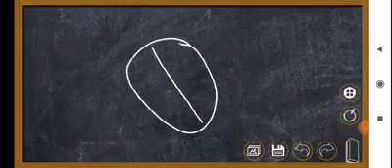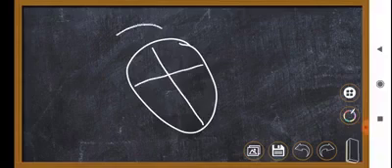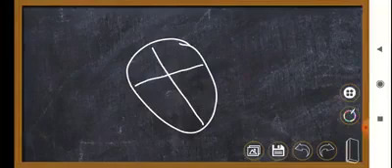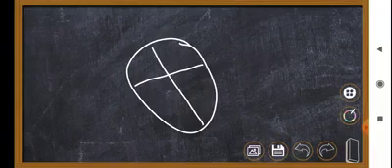Suppose this is a heart, and we have to look at all the electrical activity occurring inside it, right? So we must have different eyes at different places to look at exactly what's happening and where it is happening.